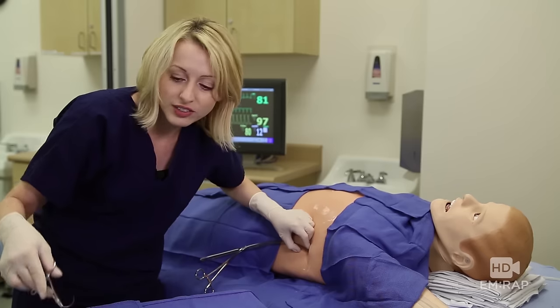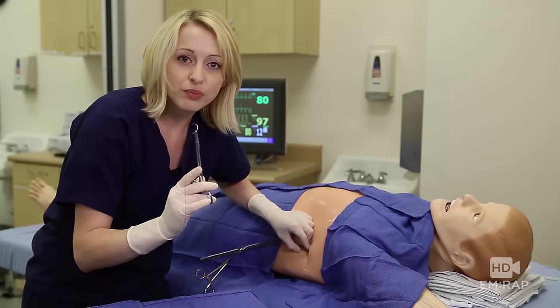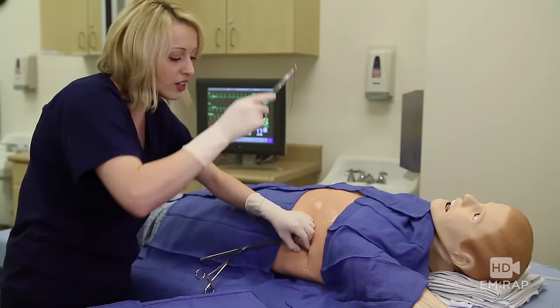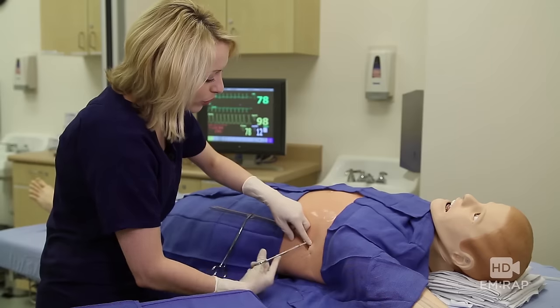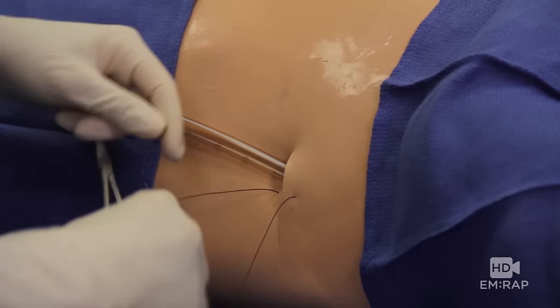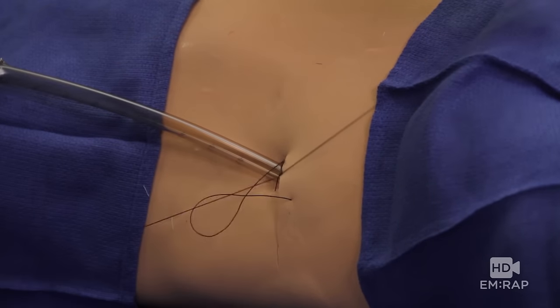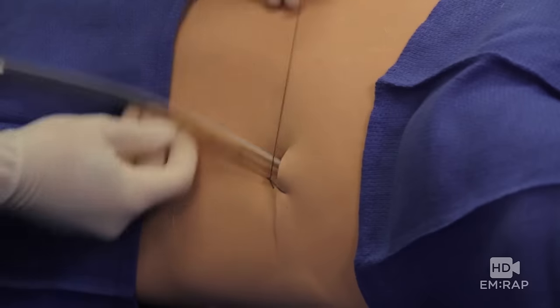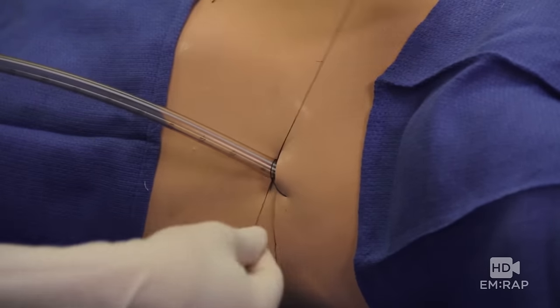Now we're going to suture it in place. Get your O-Silk — remember there's no proven superior method for suturing in a chest tube. Here's one method I like: make a simple interrupted suture on one side, pull through so you have equal ends of suture on either side, and tie a surgeon's knot. This is your anchoring knot. Wrap the ends around the tube and tie.